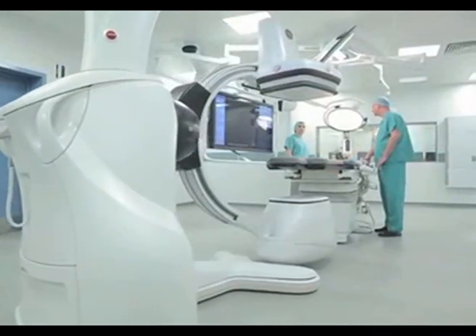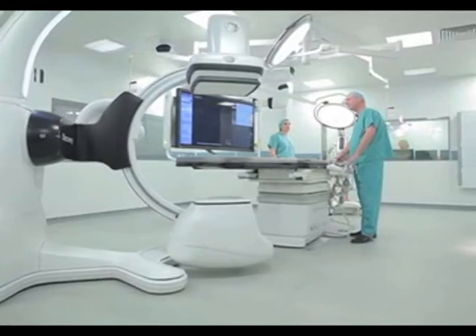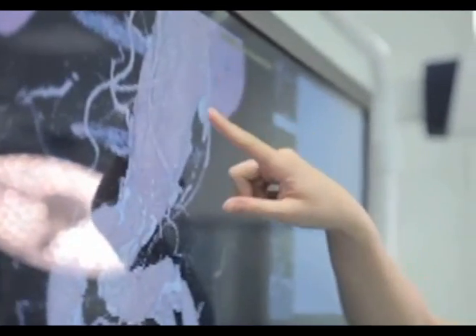The hybrid operating theatre provides us with the best of both worlds. So we have good lighting, sterility, operating theatre facilities. At the same time, we have high-end imaging, as it was only available in X-ray departments in the past.